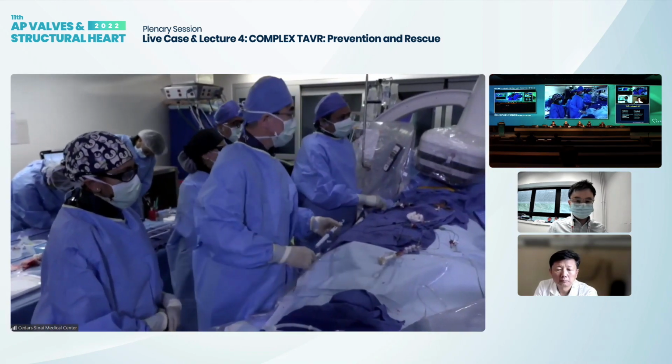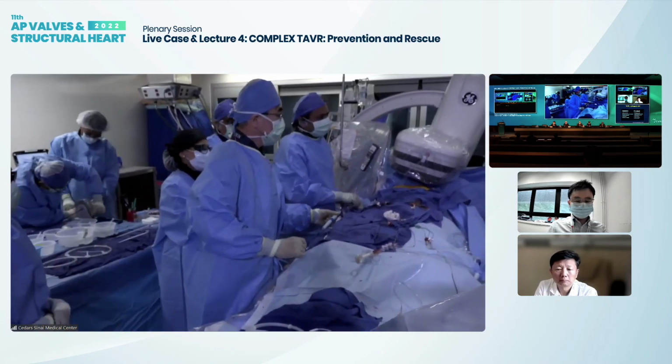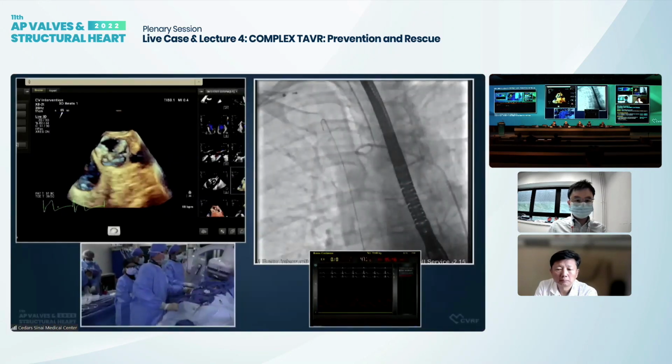So, as you may have some questions, we are just going to go ahead and advance the Sentinel device.